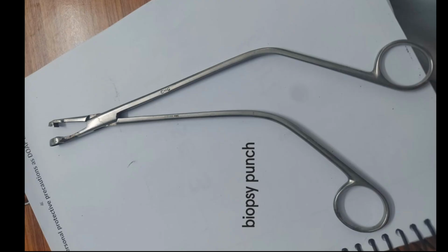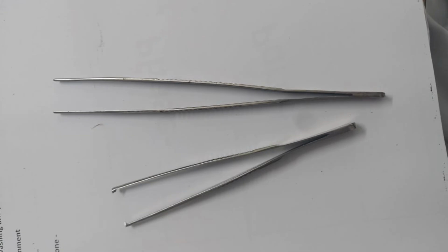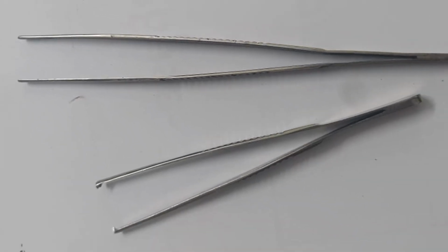Okay, here you can see this is a cervical punch biopsy forceps. Okay, this is used to take a biopsy of the specimen for cervical carcinoma, caused by HPV 16 and 18 most commonly. Okay, these are the two forceps, that is toothed forceps and the plain forceps. Toothed forceps hold tough structures like fascia and aponeurosis. Smooth non-toothed forceps, that is plain forceps, is used for holding the soft structures.